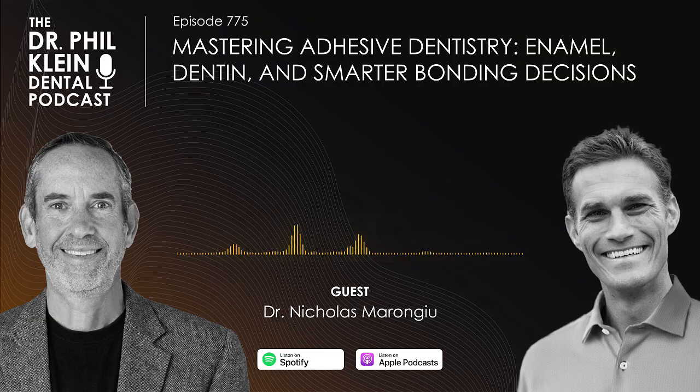But if we've got dentin exposed in those preparations, or we're doing partial coverage crowns, historically we used to do total etch, and then we had to manage the hypersensitive dentin and manage the patients if we wound up with sensitivity afterward. What we've moved to is that universal adhesive, but with selective etching enamel, using an etchant gel, getting that really nice demineralized enamel around the edges to get that great seal, using the gels to keep it only on the enamel, away from the dentin, and then using the universal adhesives to prepare the dentinal surface, so that we don't risk hypersensitivity of the dentin from the etch.